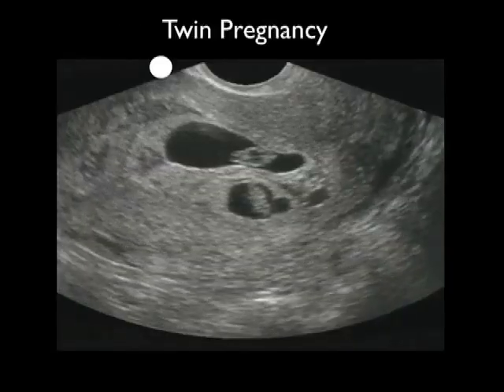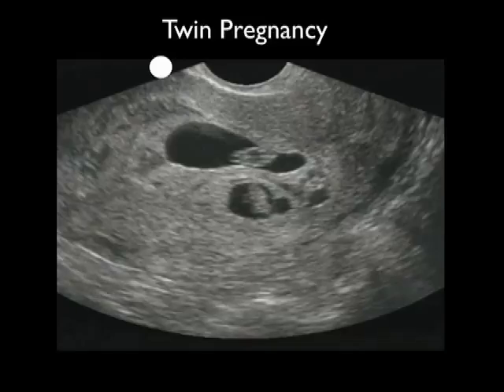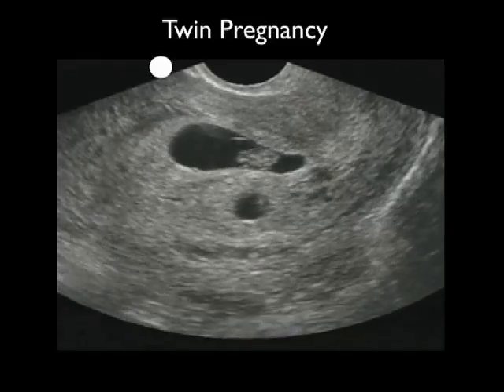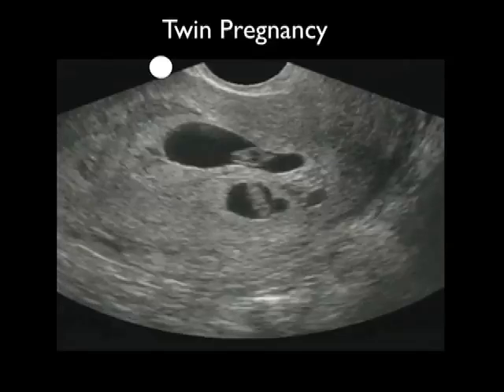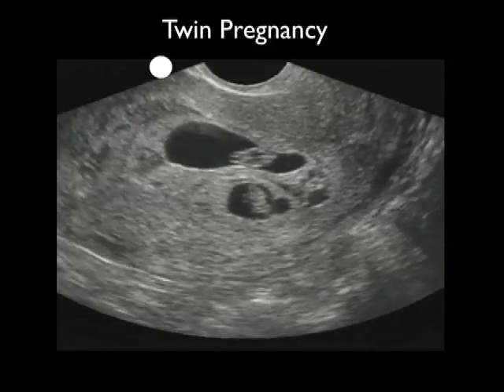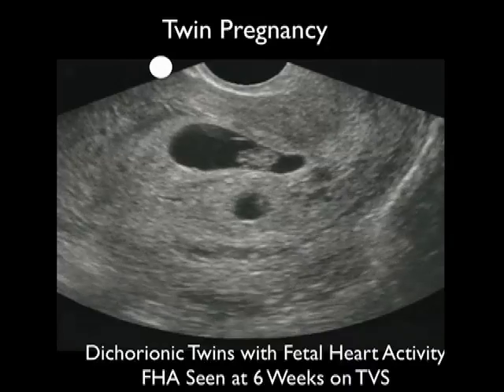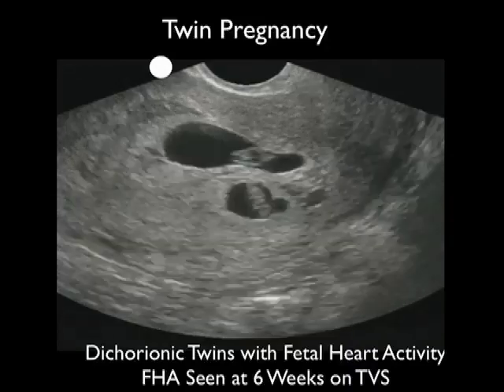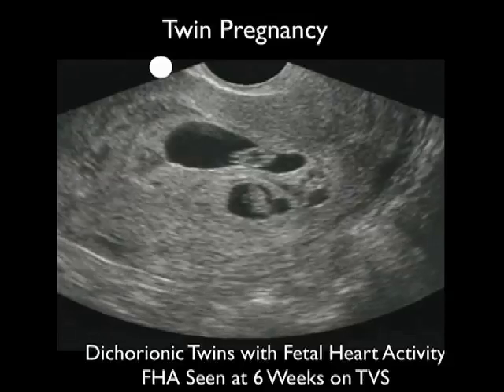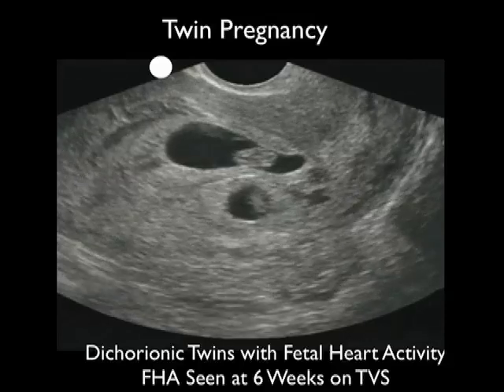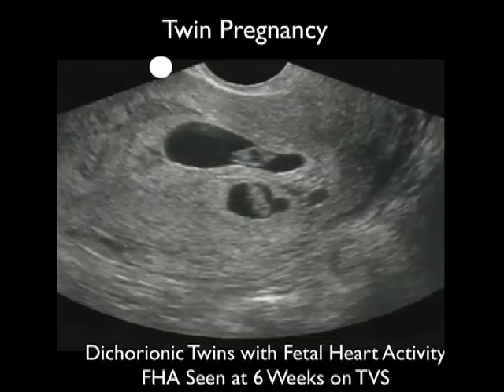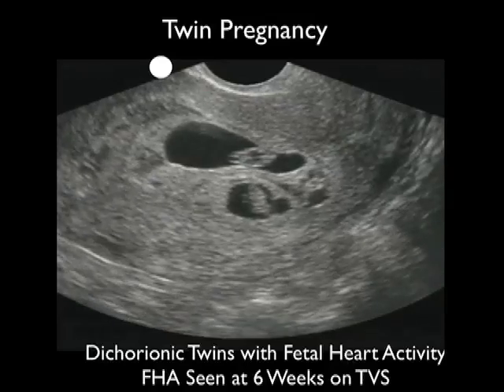Here's an interesting video clip showing a twin pregnancy. We see two gestational sacs, signifying dichorionic twins. Within each of the gestational sacs we can see little fetal poles with a flicker of heartbeats. Recall that fetal heart activity is seen at about 6 weeks on transvaginal sonography and about 7 weeks on transabdominal sonography.